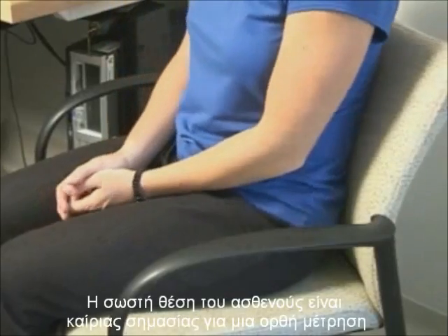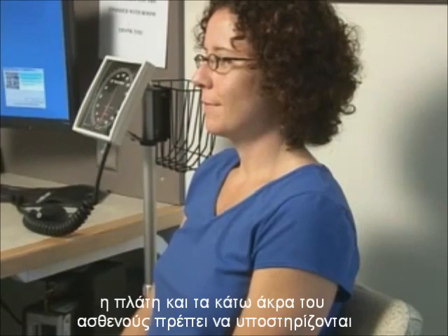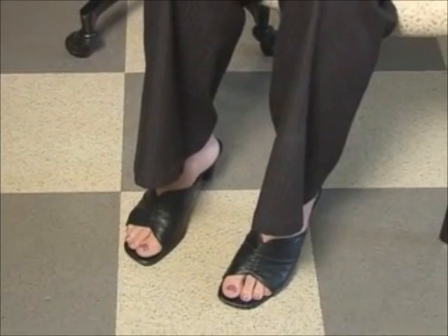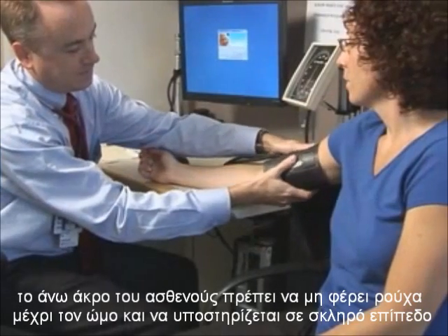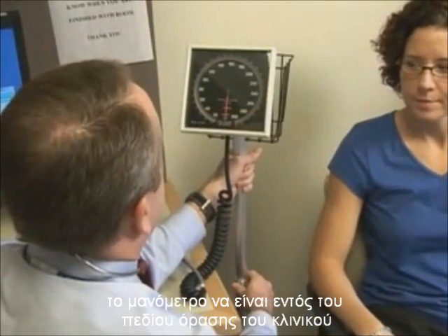Correct positioning of the patient is essential to accurately measure blood pressure. The patient's back and legs should be supported with legs uncrossed and feet resting on a firm surface. The patient's arm should be bare to the shoulder. The arm should be supported at heart level. The manometer should be at the eye level of the healthcare practitioner.